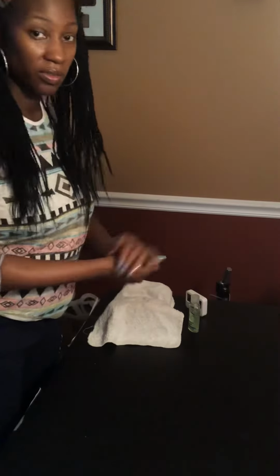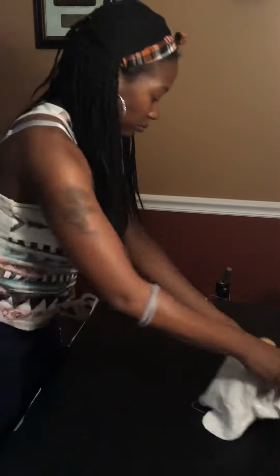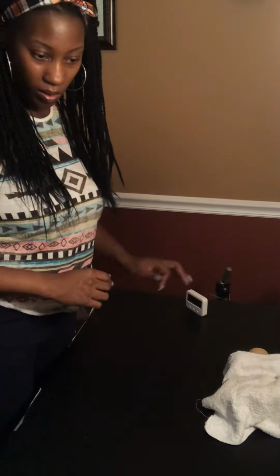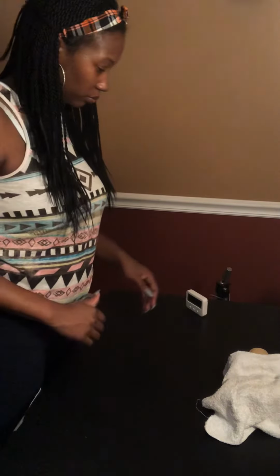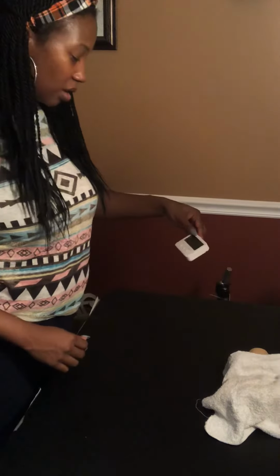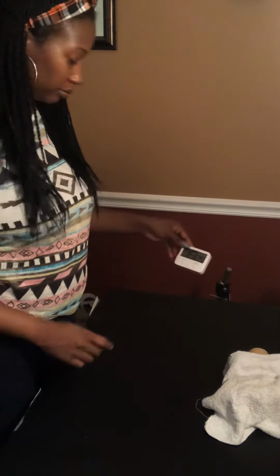Sanitize your hands. Put your stuff back. Document. And that took 11 minutes.